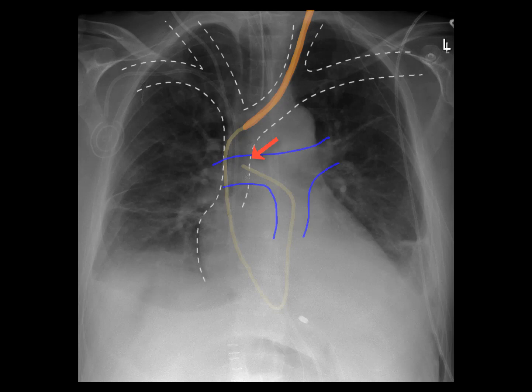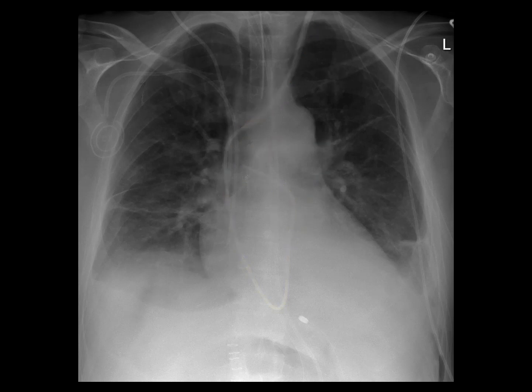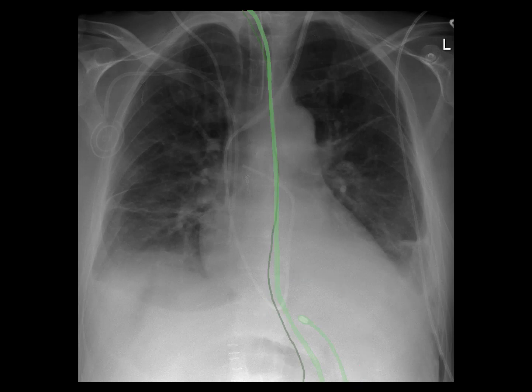The tip of the Swan-Ganz catheter is in the right main pulmonary artery. This patient also has two enteric tubes, one of which is more typically seen as a feeding tube, and this one is looped back upon itself in the stomach, normally with its tip in the jejunum. The other tube we can barely make out is the skinny radiopaque stripe within it, extending into the stomach and off the inferior margin of the film.